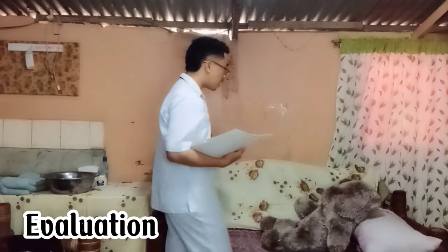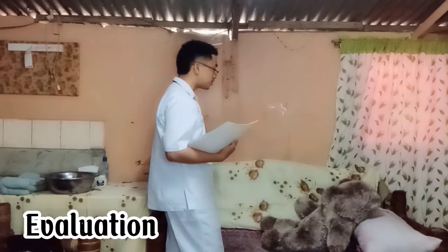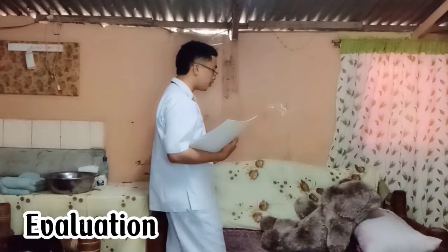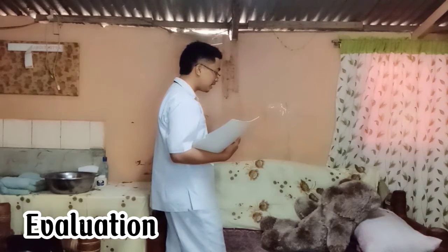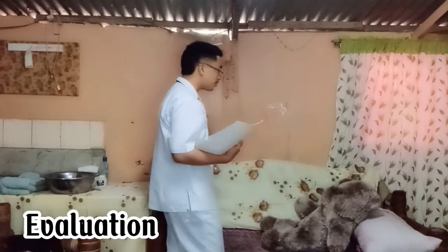So, ma'am, do you feel any relief as I administer the enema? Naginhawaan naman po ba yung pakiramdam nyo? Or do you feel any pain or any discomfort? Okay, that's good.